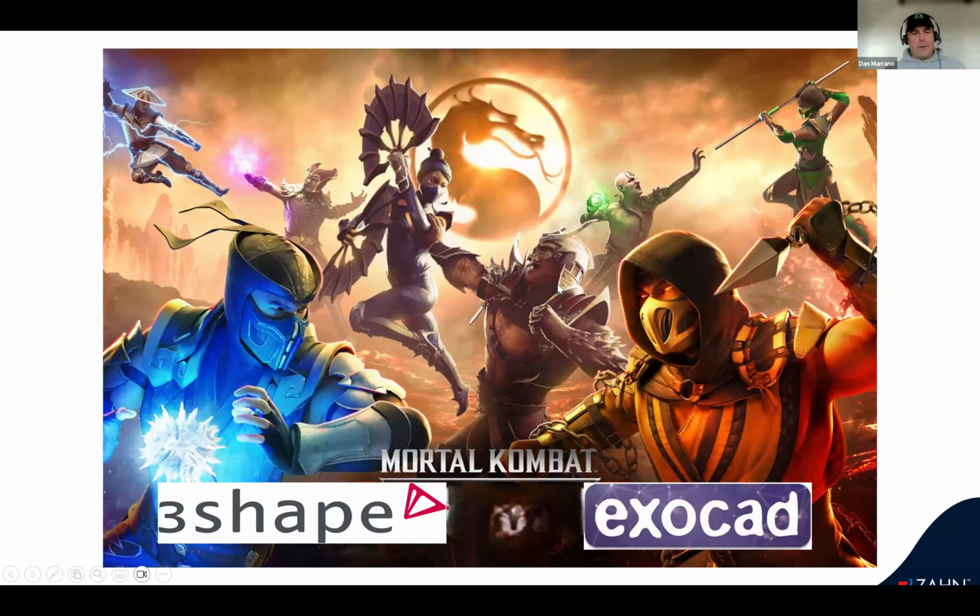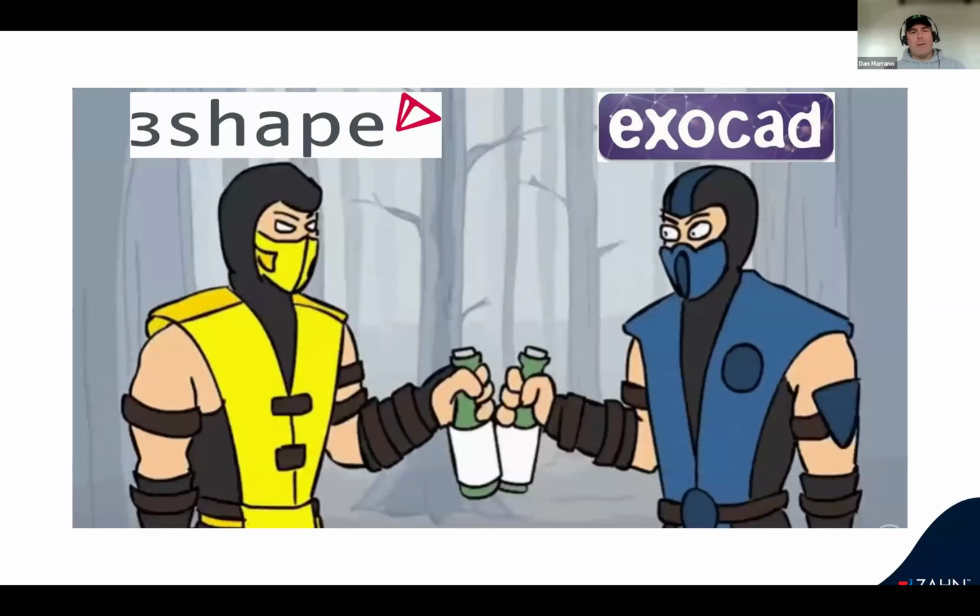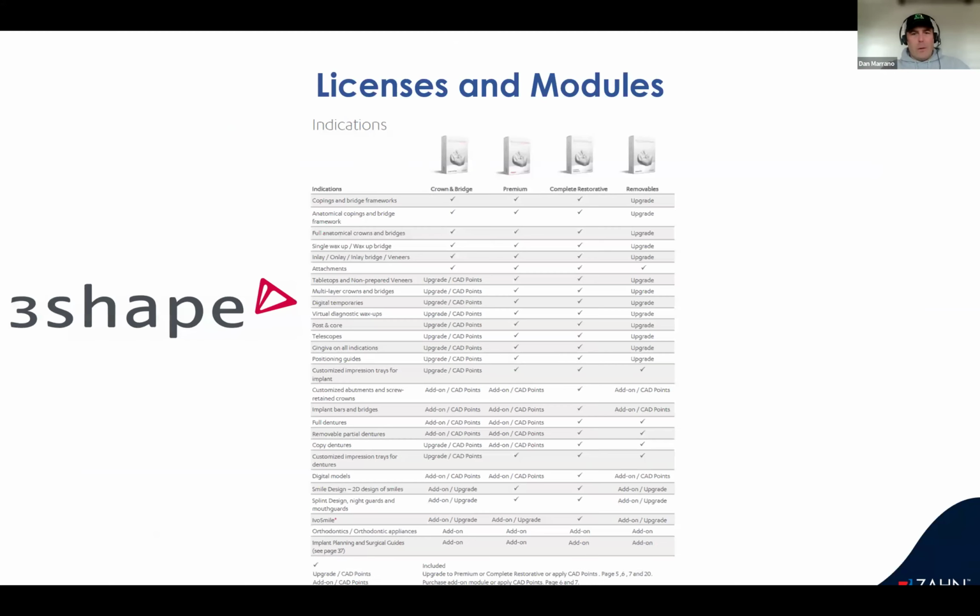So like I said, 3Shape and exocad have been so polarizing. It's the Mortal Kombat of digital tools, and we don't really have to battle it out this way. We can all kind of friend each other and get along. Let's find a common ground, and that's what I set out to do a few years ago.